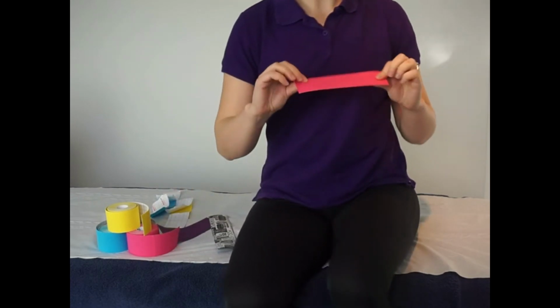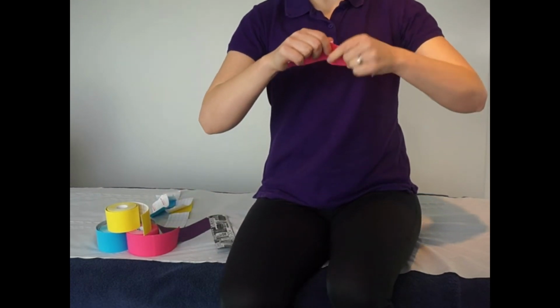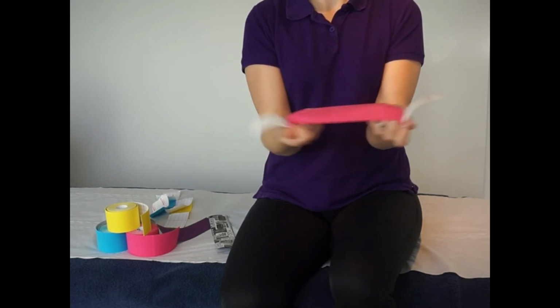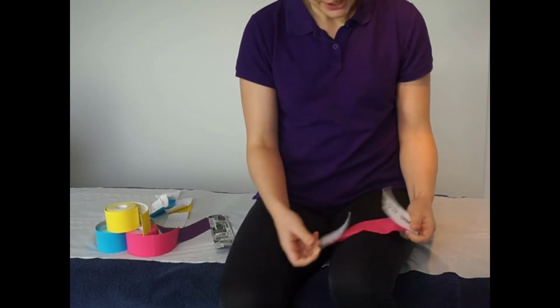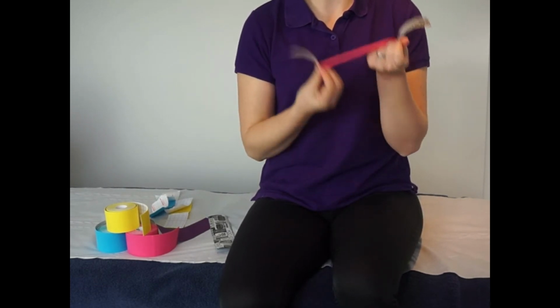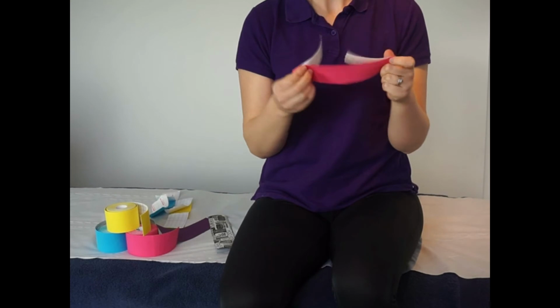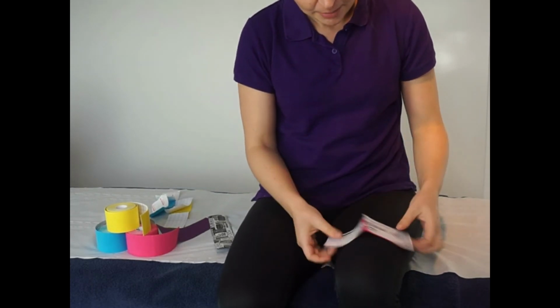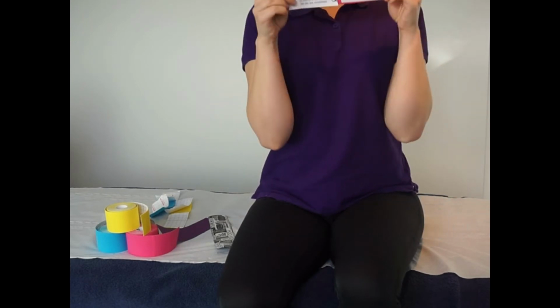Then we have the pink tape. So again, same test, we're going to break open the paper and pull away. Again, same thing. It's not very sticky, that's not going to last if our clients are going to be going to the gym or exercising or even taking a shower. And again, with that recoil, if I put the paper back on, you can see that gap from there.